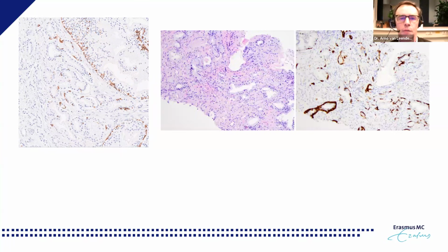Unfortunately, you can also find these areas, very rarely, on biopsies. For instance, this is a biopsy, in my opinion clearly with an invasive adenocarcinoma, but when we did a basal cell staining, and I don't know why we did that in this case, you could still see that there are some basal cells present in some of these invasive-looking glands.